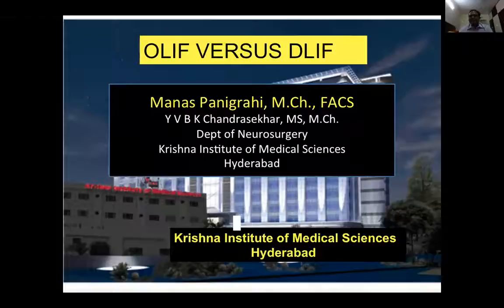When Divya asked, I thought we'll speak about anterior minimally invasive surgery, because that is more rewarding than a posterior approach. Unlike posterior, where minimally invasive surgery has a higher complication rate, in anterior minimally invasive surgery the complication rate is quite low. It's a technique which not only reduces blood loss, but is also quite patient friendly and friendly for the surgeons.